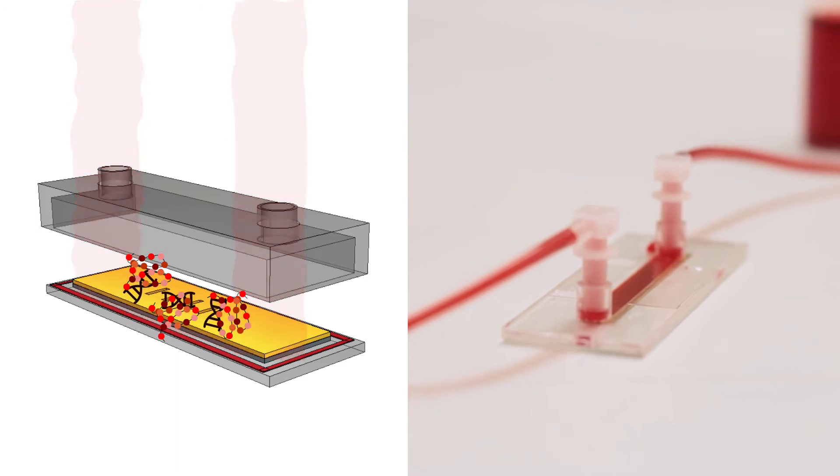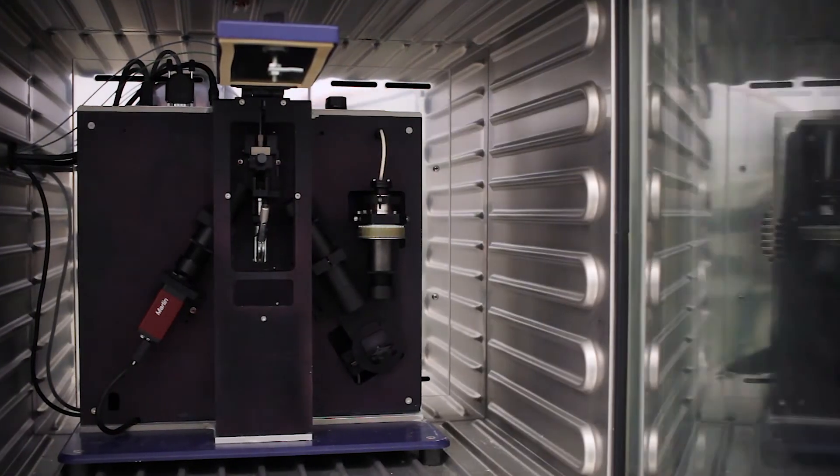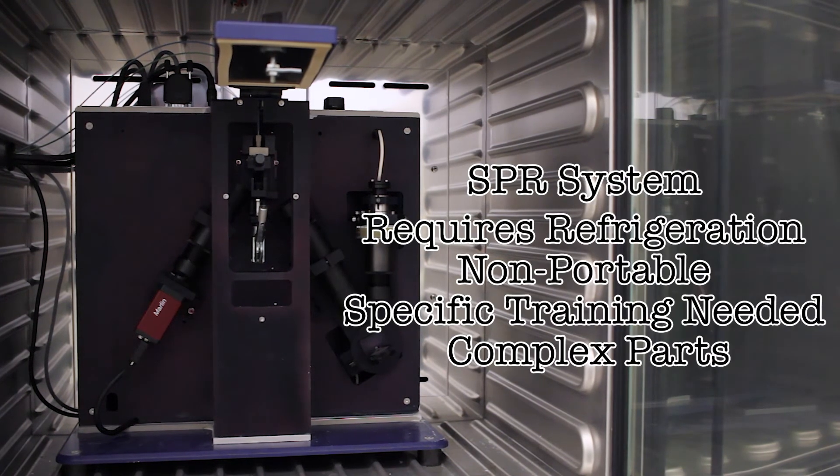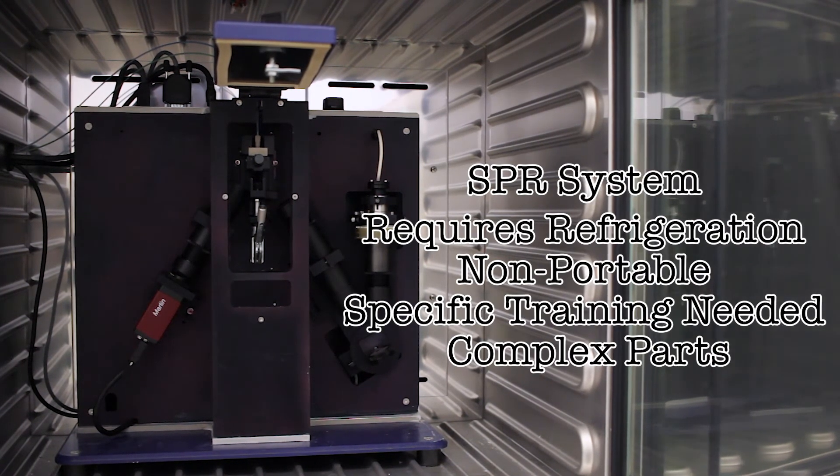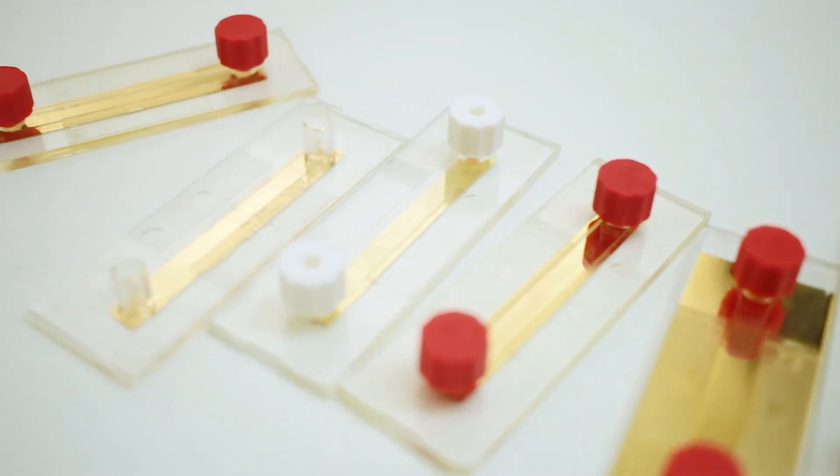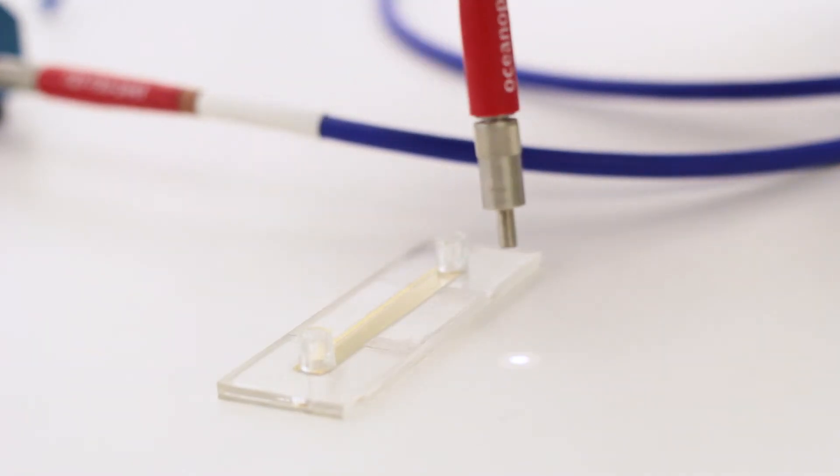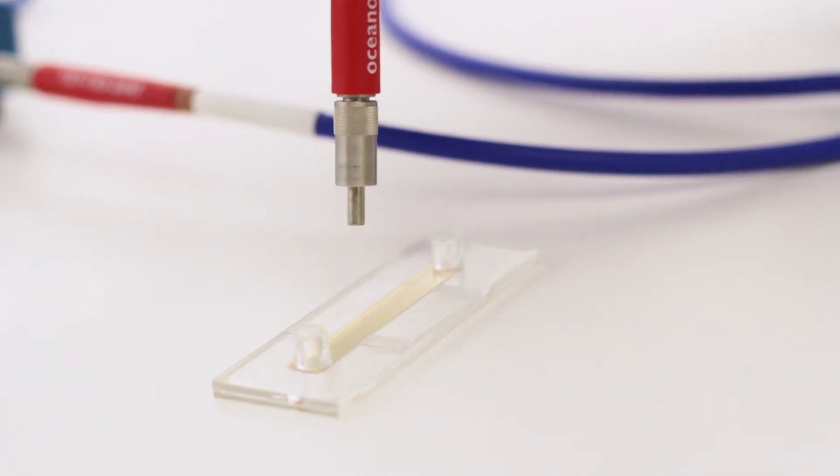The technique is very sensitive, but requires a laser and fancy optics yielding a large, expensive instrument. We made an inexpensive version to fit in the palm of the hand. Our nanostructures allow for the laser and optics to be replaced with a simple light bulb and camera, and allow for analysis of whole blood samples.